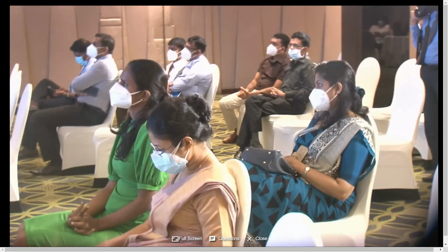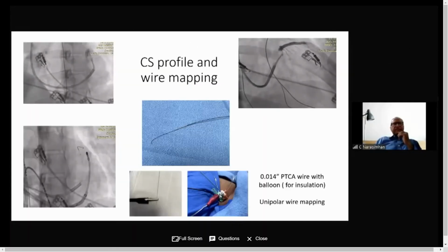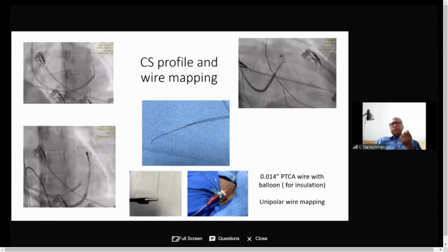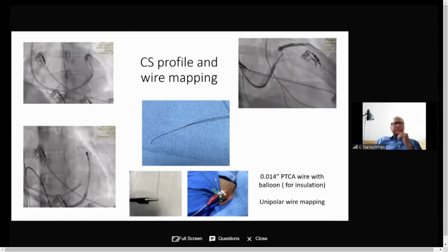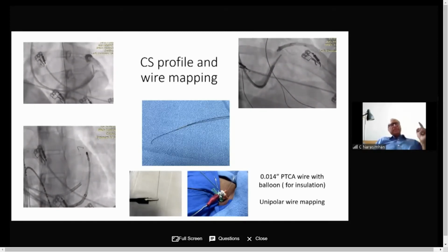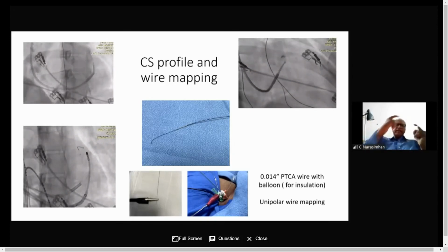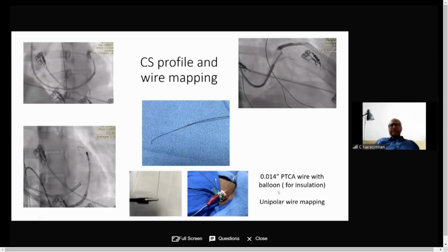Most of the epicardial ablations are for VT. And whenever you have failed WPW, we would have done probably about 5-6 pathways going through the epicardial space, but it's very uncommon. Atrial tachycardias, especially appendage tachycardias, when you go from inside out, your potential for injury is higher. When you come from outside in ablation, it is much safer. So again, rarely you have these situations.